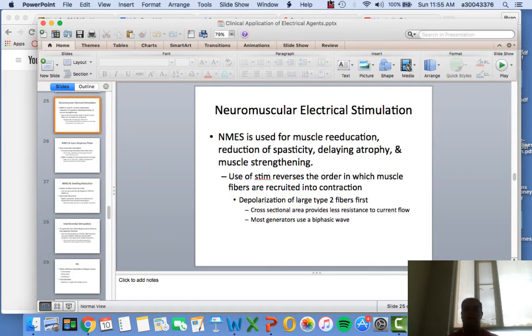NMES, Neuromuscular Electrical Stimulation. I'm going to pause this real quick. Okay, back.